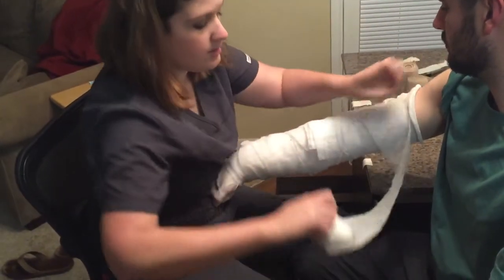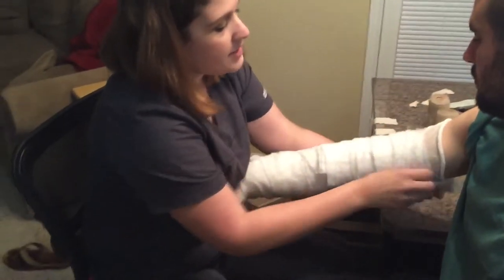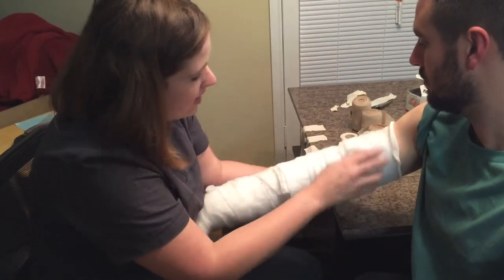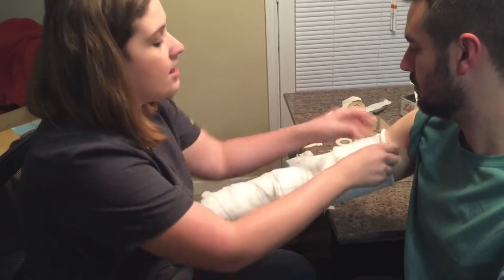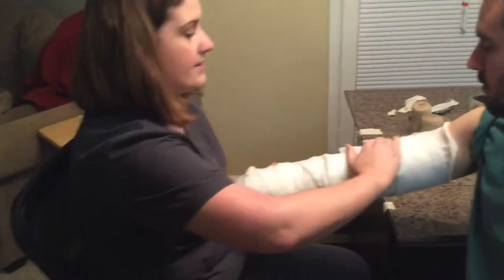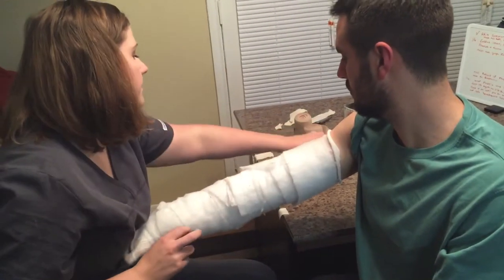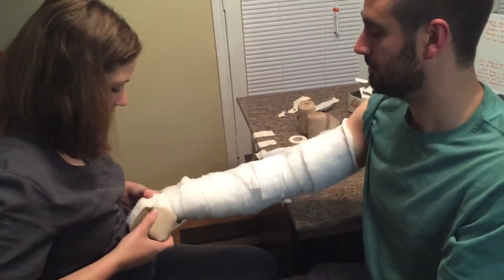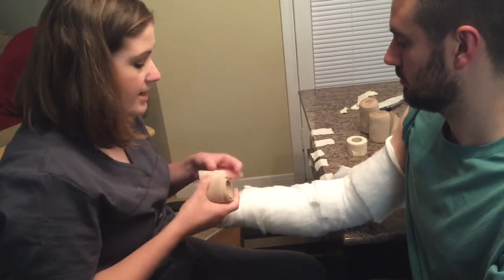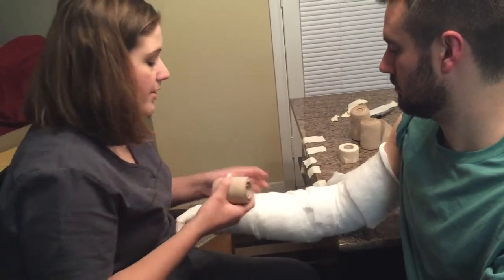You want to know that you should wear this 24 hours a day, and you can change it. Once you learn how to do it, we'll teach you more. You'll be wearing it, and especially on plane rides and long car trips, you want to make sure you wear it. Now you can see that the whole arm is kind of the same size, and we need to go all the way up, but always make sure you stop two fingers from your underarm. Next thing you do is this elastic short-stretch bandage. Since we're going to wrap your thumb, we want to make sure that we are orienting the wrap toward your thumb.